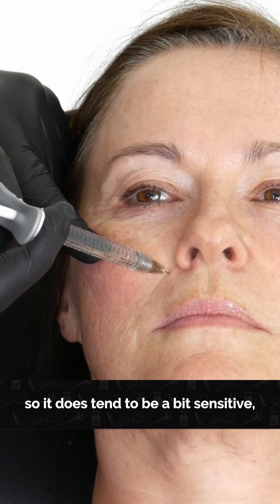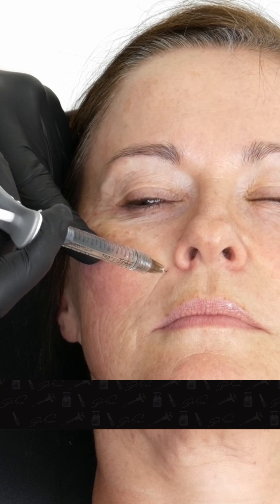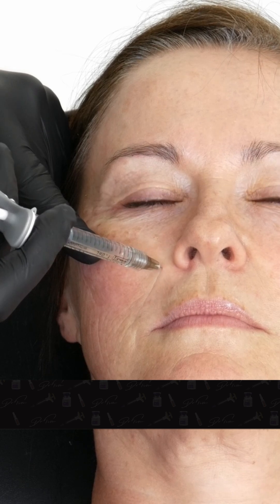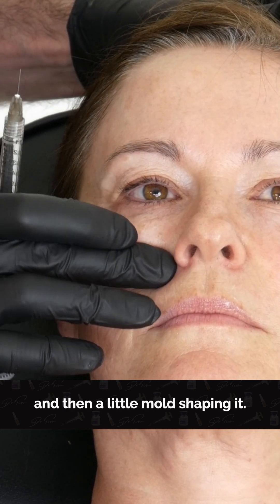There is a nerve here, so it does tend to be a bit sensitive. And then a little mold, shaping it.